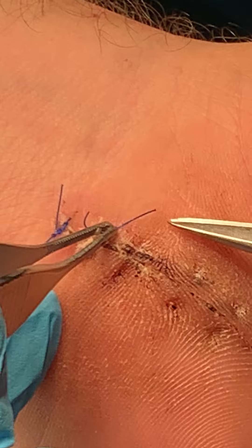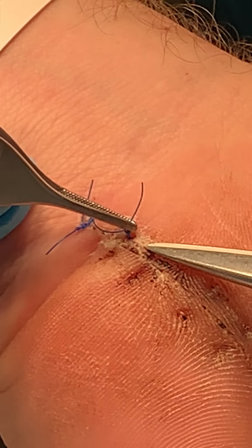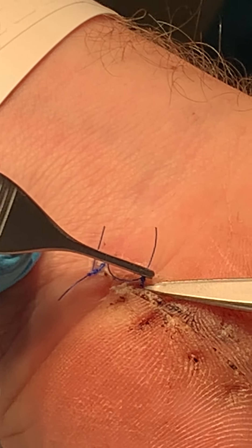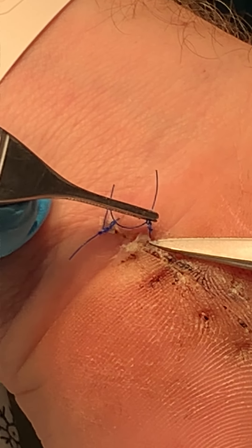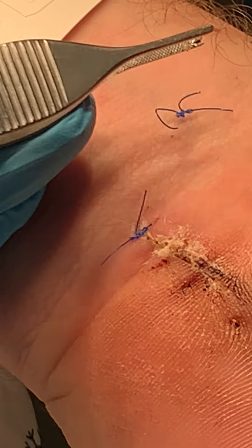Here, it's more embedded and the skin is softer. So again, I'm going in — I cannot actually see too much of the suture, but I'm just going in slowly, kind of nibbling, and then as I pull I know I've nibbled enough to get it through because it comes out.